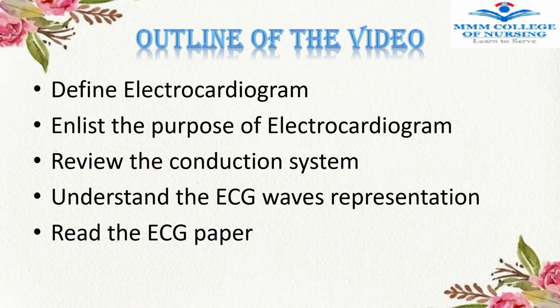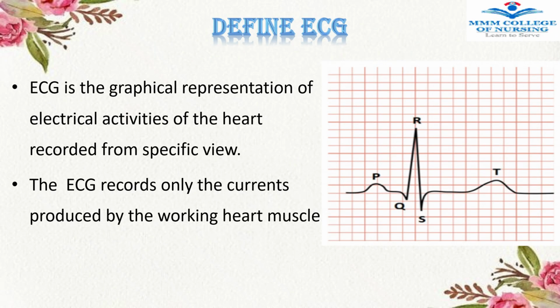These are the specific objectives outlined in this video. ECG is also known as EKG, that stands for electrocardiogram. ECG is considered the gold standard investigation in cardiology because of its non-invasive nature and its ability to provide valuable insight into the heart's electrical activity.